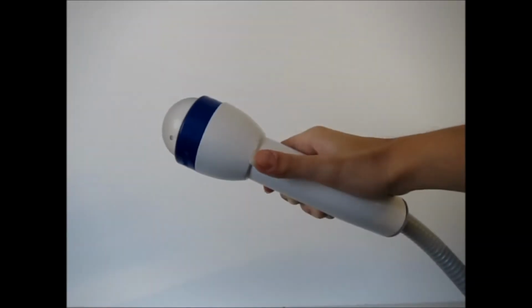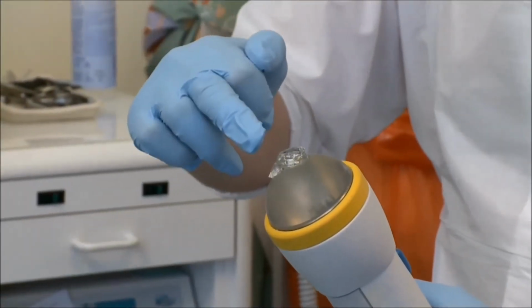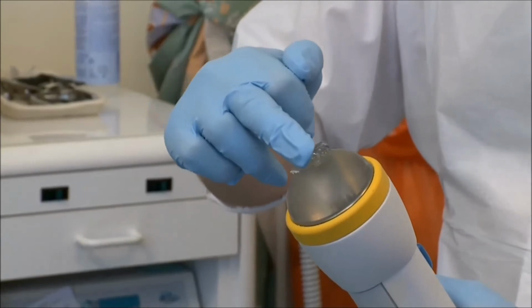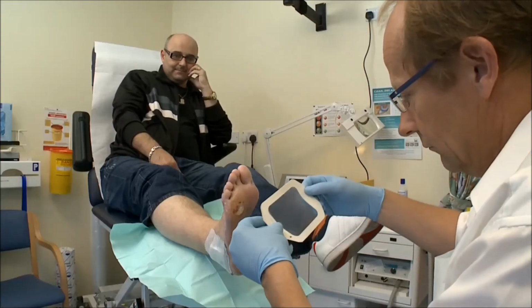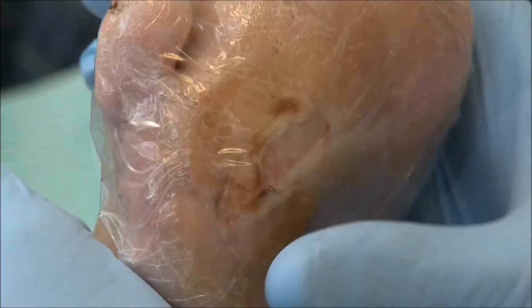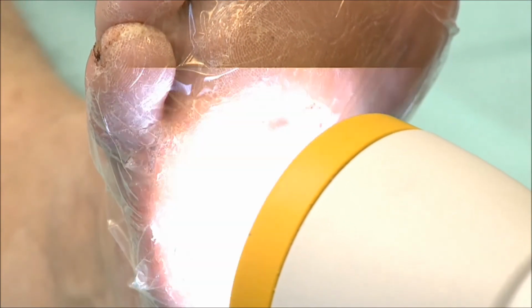8. Applying ultrasound gel. Shockwave treatment is only effective if there is liquid between the applicator and the skin. Therefore, we use ultrasound gel, which can be applied directly to the water membrane. For treatment of wounds, we recommend putting sterile ultrasound gel directly on the wound, then covering it with sterile foil, and using standard ultrasound gel directly on the applicator as usual.